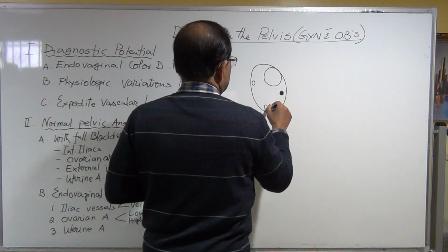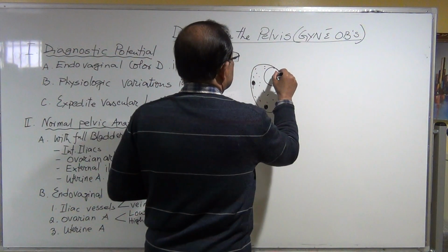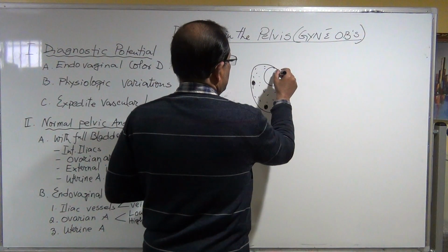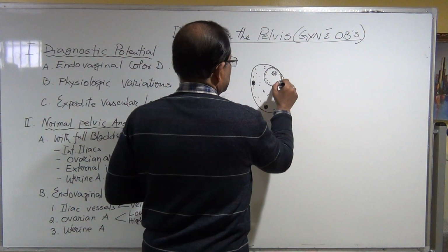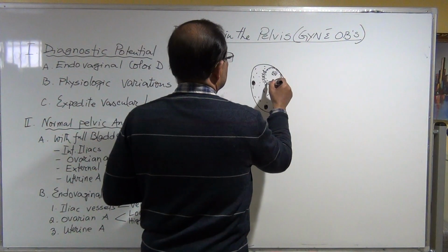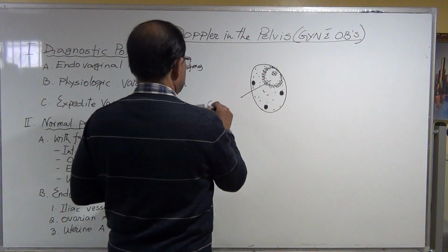These are the small follicles, and it has a cell, that is an ovum inside, and you know the ovum has layers of cells, that is granulosa cells, theca cells. So this is, say, a Graafian follicle.